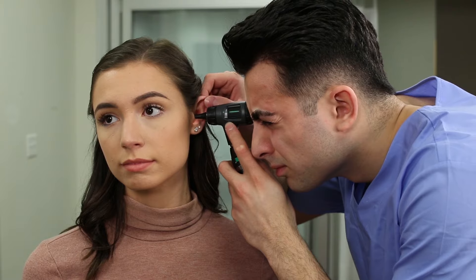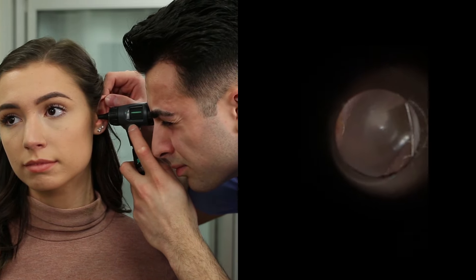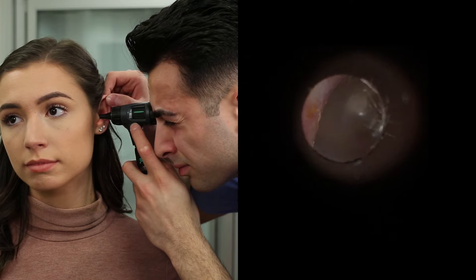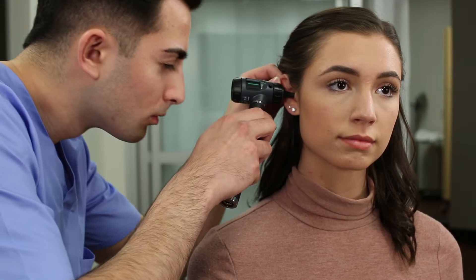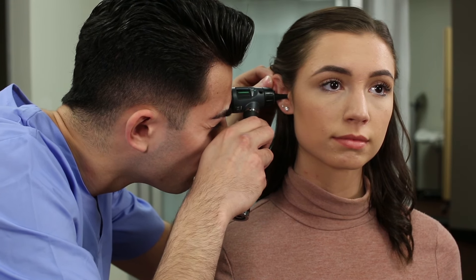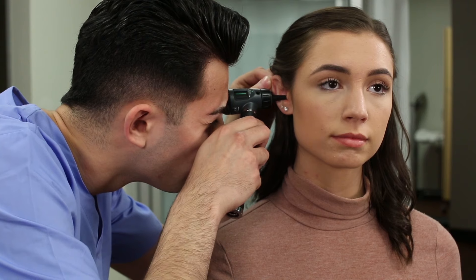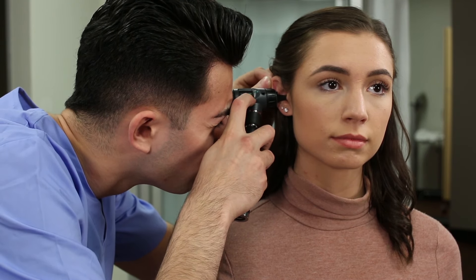It's best practice to examine the healthy ear first. This allows you to see the patient's normal ear anatomy and compare to the other ear, while helping to prevent the spread of infection. Straighten the outer ear canal to make insertion of the speculum easier. Guide the otoscope into the patient's ear to view the canal and tympanic membrane.